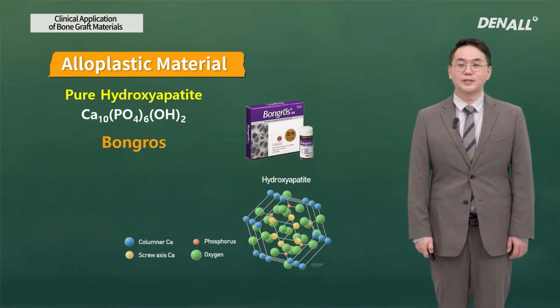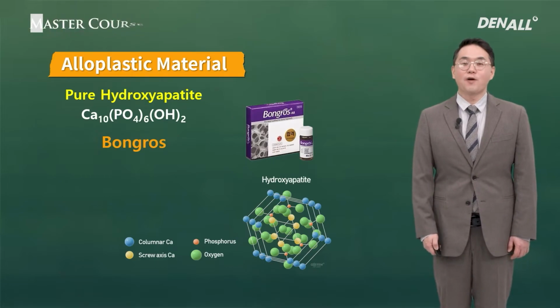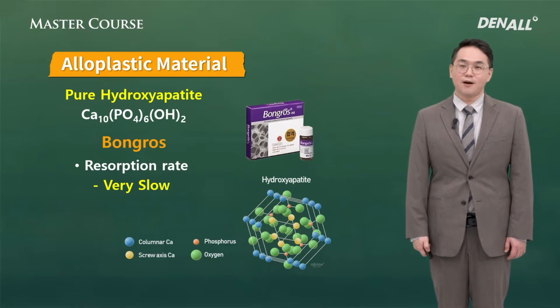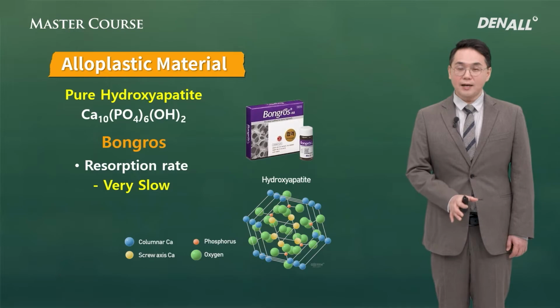Next, pure hydroxyapatite. As you can see, the chemical formula is very complicated and stable. It takes 6 to 8 months for resorption. It is very slow to be resorbed.